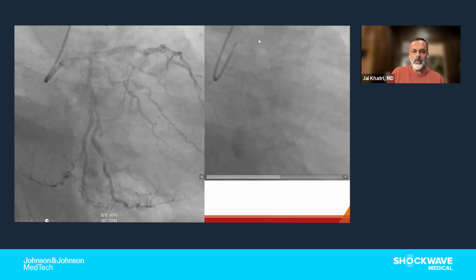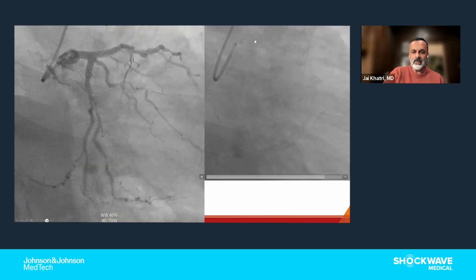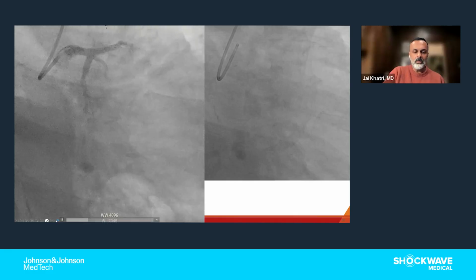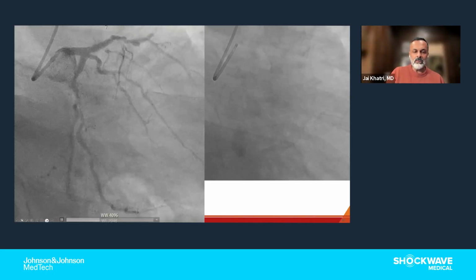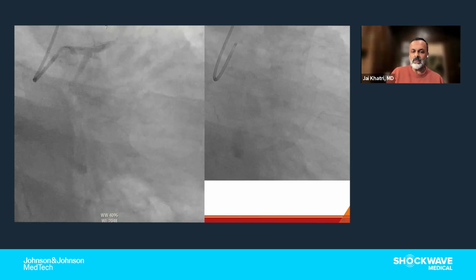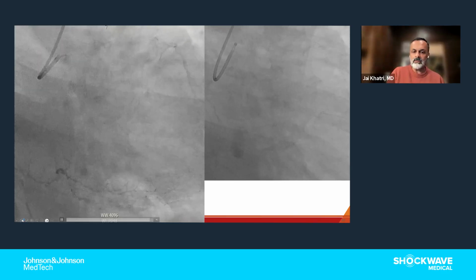You can see where the MAC is around the mitral valve, and you can follow above the MAC. You can see all the calcium in the circumflex and down the LAD. So a heavily calcified coronary tree with a last remaining conduit, with CTOs of the LAD and RCA and a depressed EF. And the question really for the panel is, how would you approach this?